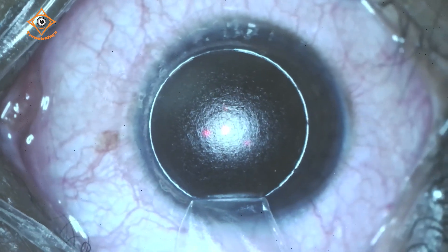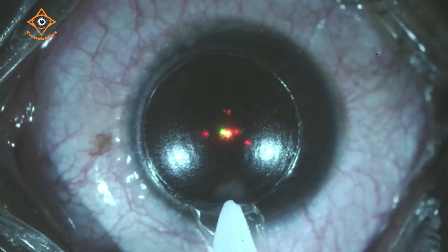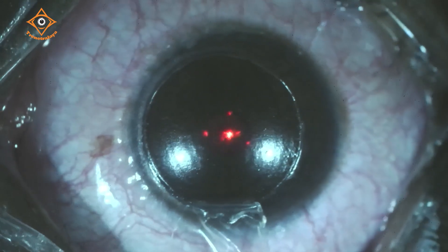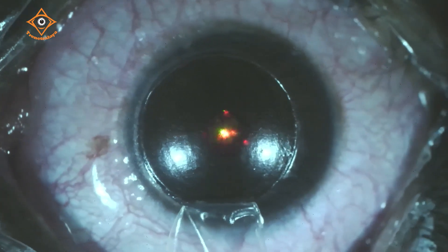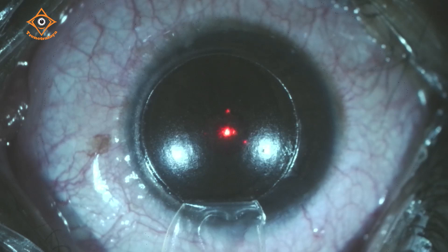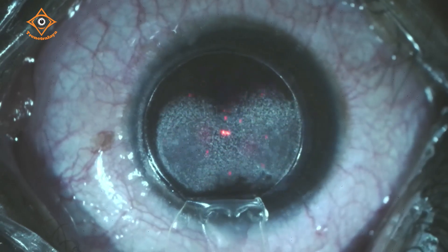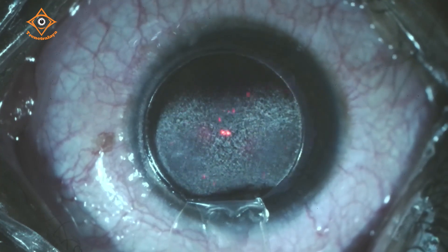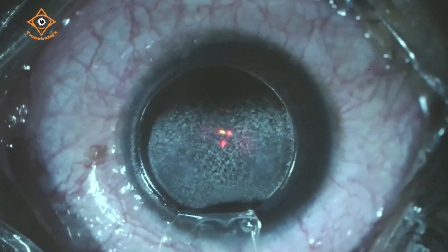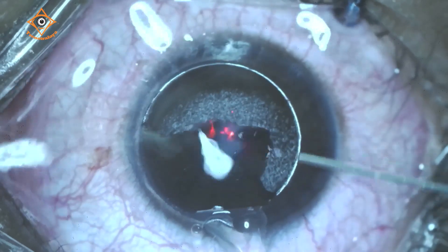We have asked the patient to look at the center green light and we are going ahead with the laser treatment now. There is a pupil tracker on — a very fast pupil tracking device. We are all set with the laser. Green light, green and red light — starting the laser now. The laser is over — it is a very fast laser, about 1.3 seconds to correct one diopter.